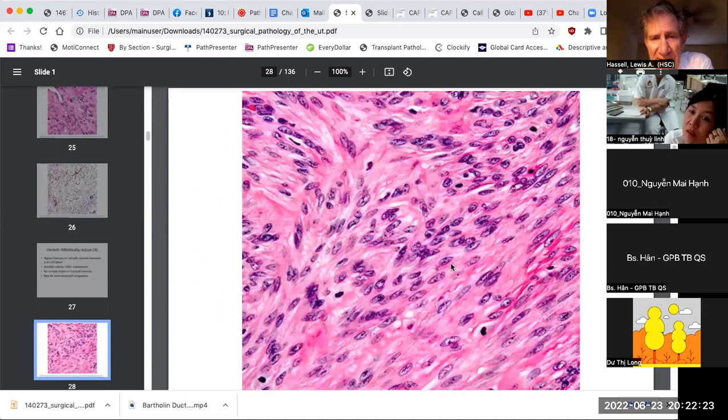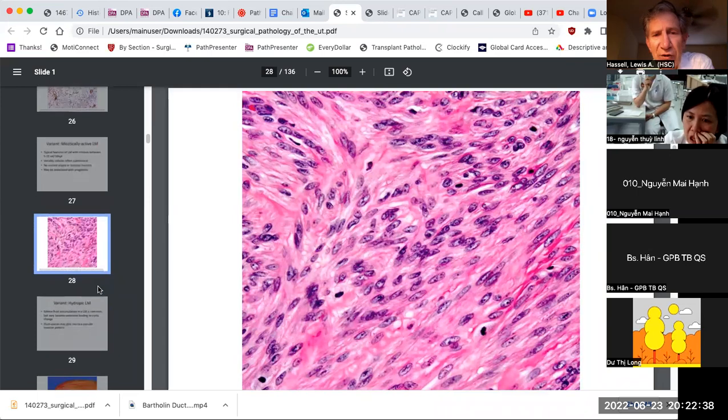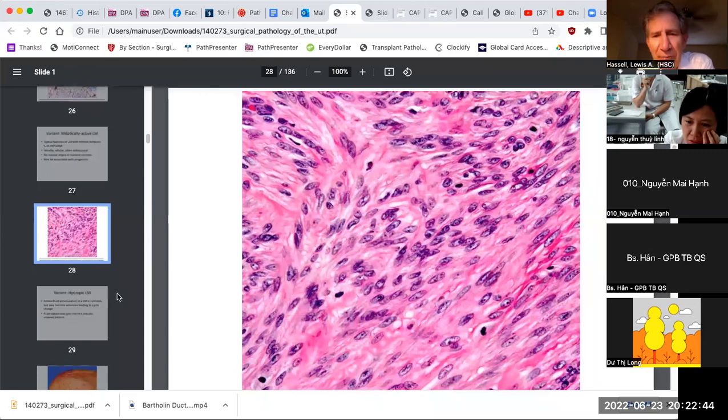So again, they don't look atypical. Here's an example. Here's a mitosis, here's a mitosis. So we can find several mitoses or things that look like them with relative ease. And once you see them, you have to start counting them. If you don't see them and you don't count them, that's not a bad thing. But if you do see them, you should certainly count to make sure that you have not exceeded that. I usually will count more like 50 fields. It's not just count 10 fields, and if you don't get over 15, you want to sample it pretty well in that regard.